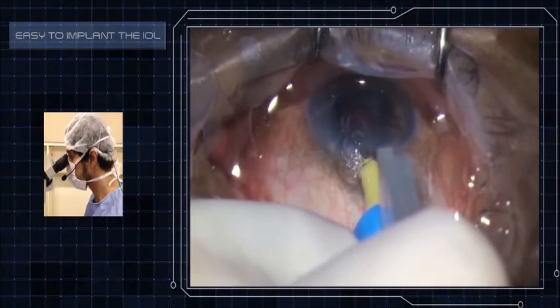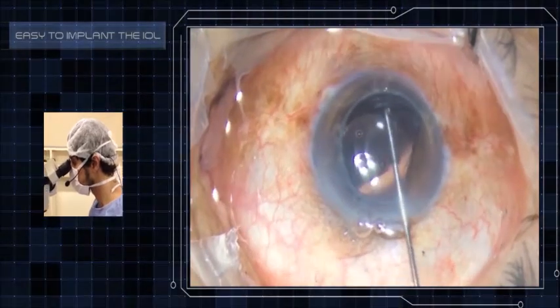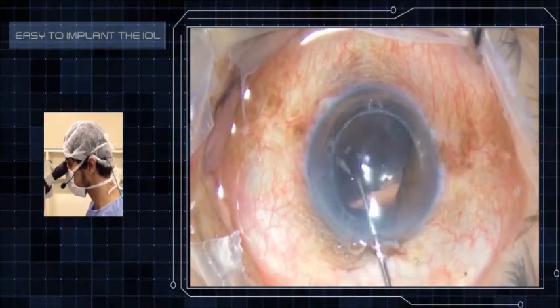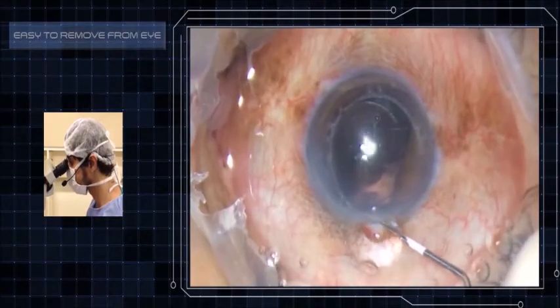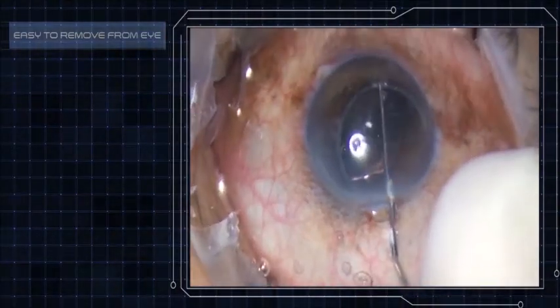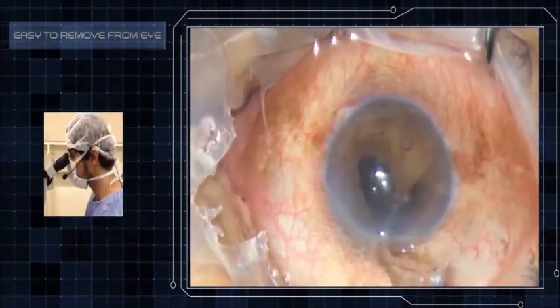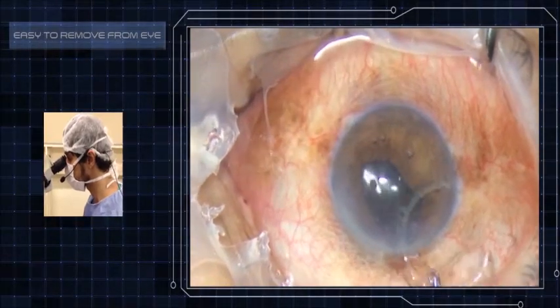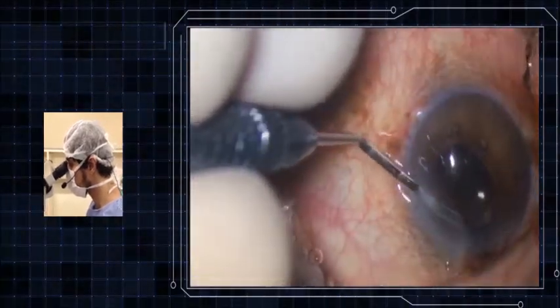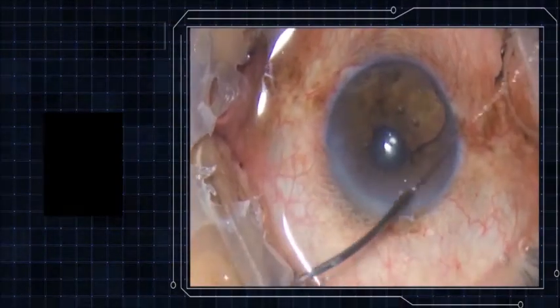Jarvis, I'm happy. I will implant the IOL. It is easy to implant and to manipulate the IOL inside the eye with the ring. Now I'm removing the ring from the eye smoothly. Oh, a little problem, Jarvis — it is normal for the first surgery. But I can easily fix it.